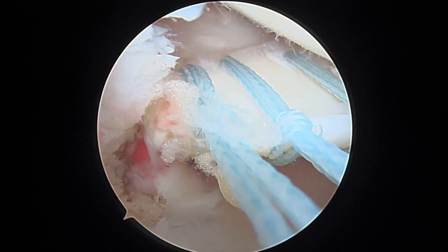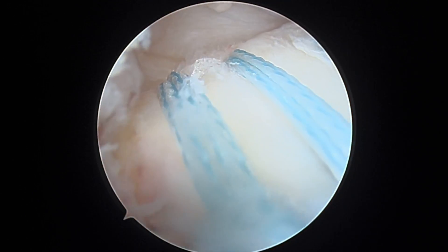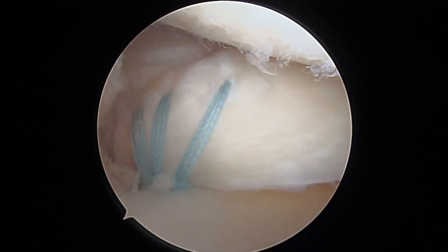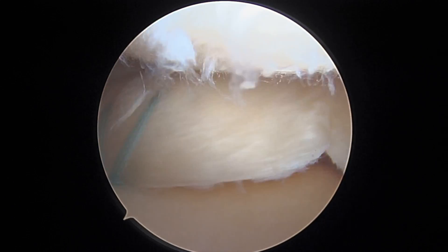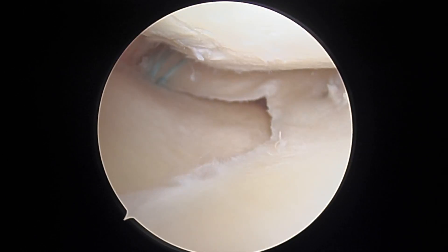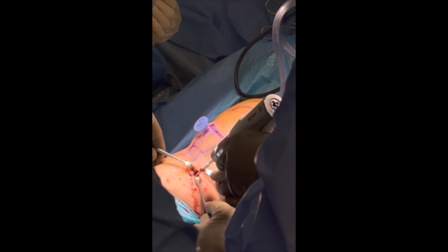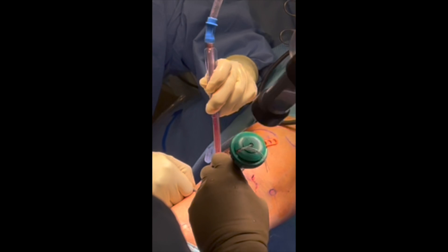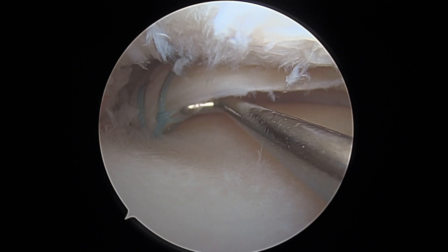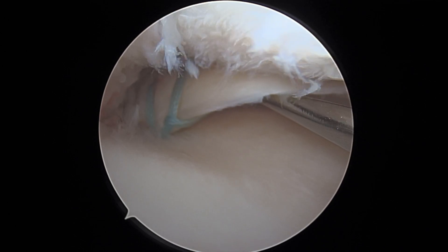After this is done, we then place a passing stitch, which is utilized to shuttle all three sutures through the tibial tunnel. We then complete the tightening of the centralization stitch and cut it, and then use a swivel lock, which is impacted with the knee in full extension to secure the root. Here are the final pictures demonstrating excellent tension and nice centralization.